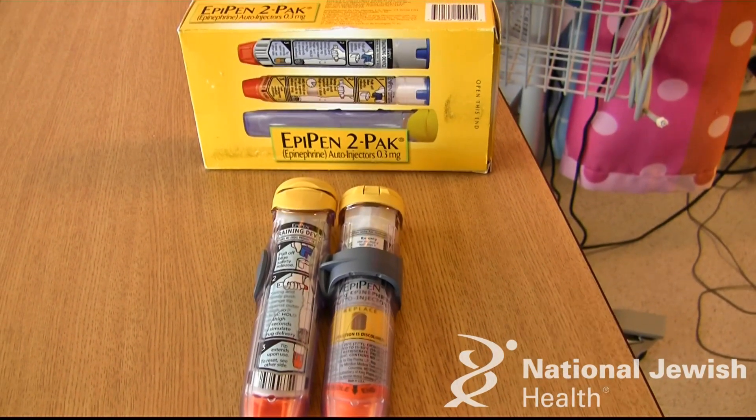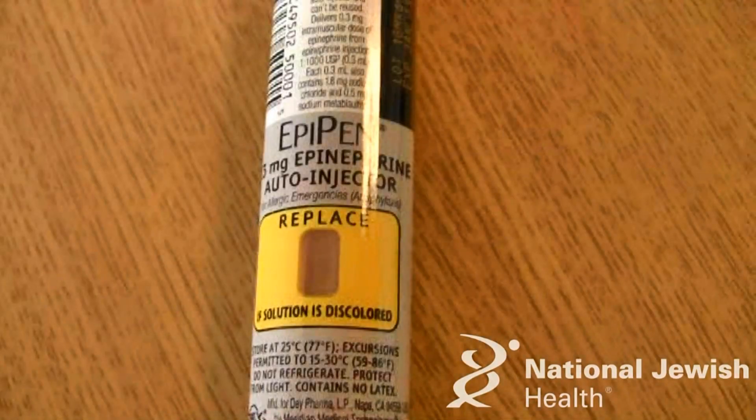Hi, my name is Emily Cole and I'm a registered nurse here at National Jewish Health in the pediatric department. I'm going to be teaching you how to use an EpiPen. An EpiPen is a very important key in saving a child's life when there is a severe anaphylactic reaction going on. Many parents are very scared to use the EpiPen, but don't be because it could save your child's life.